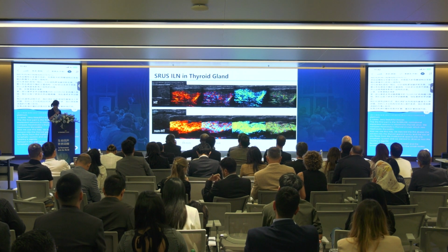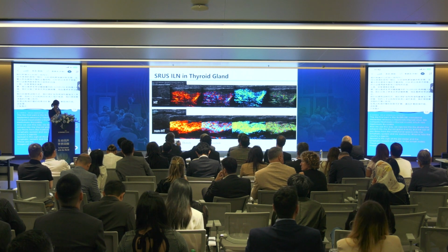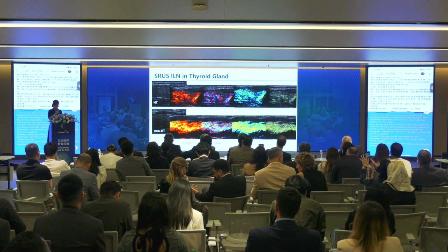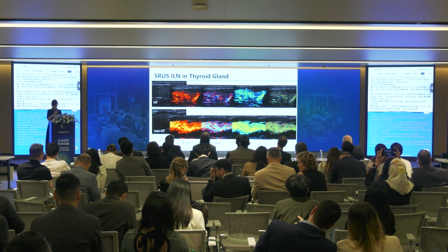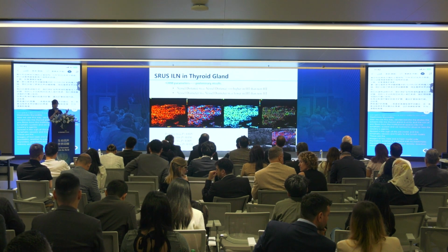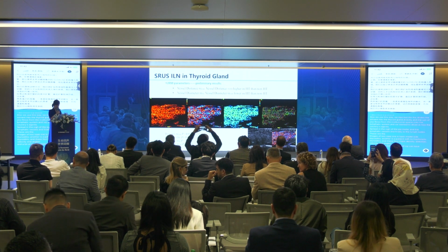These are the images of two groups. One is Hashimoto thyroiditis, another is a patient without Hashimoto thyroiditis. And these are four maps: density, direction, velocity, and angles. A lot of parameters we can obtain and accumulate to do the analysis.